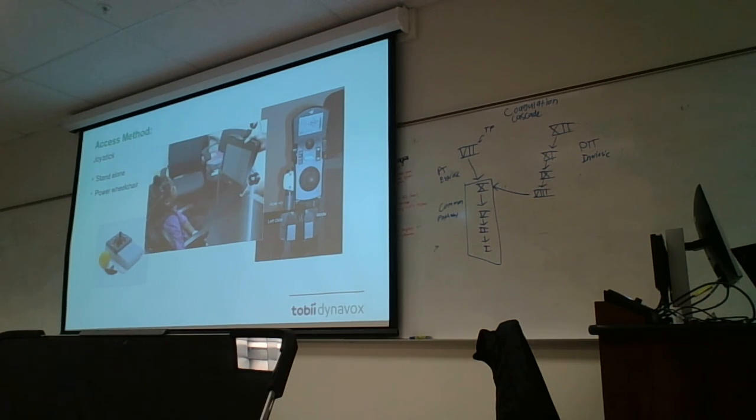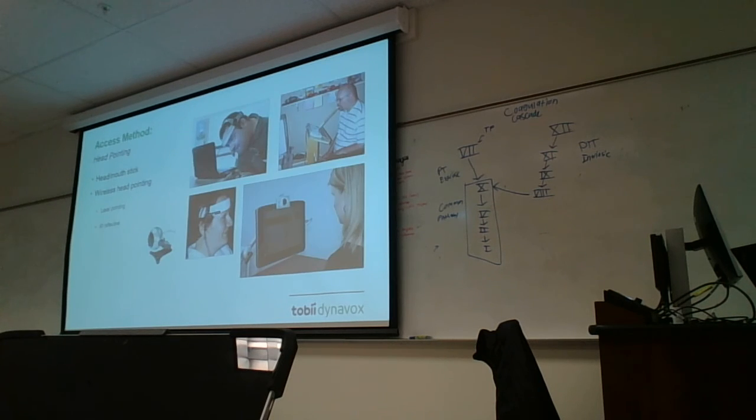There are different variations of joysticks that we have out there. And that's the head mouse that I was talking about. I feel like head stick or mouse stick I haven't seen as often. I don't know if you see those anymore. I think with eye gaze it has become more preferable than the head mousing. So that's something to consider as well when you're evaluating the patient, to see what their head and neck control is, and how fatiguing that could be after a long period of time. Whereas if you have them on eye gaze, they can sit back, and as long as their eye tracker is picking up their eyes, they can activate it, and there's not that much movement that they need to do, if any.